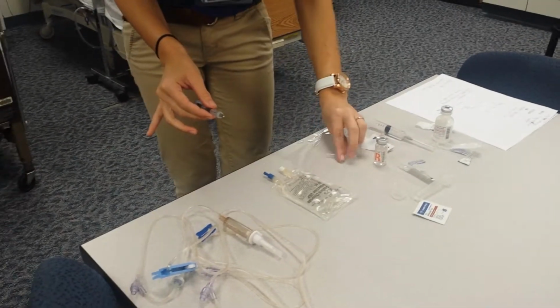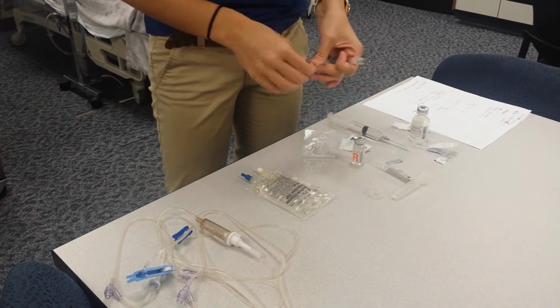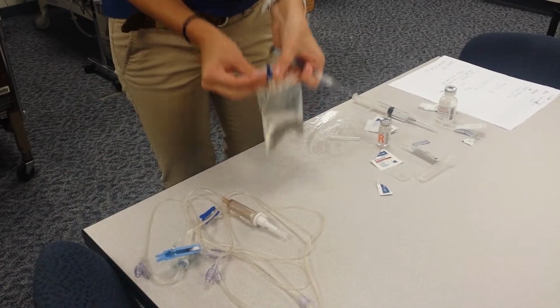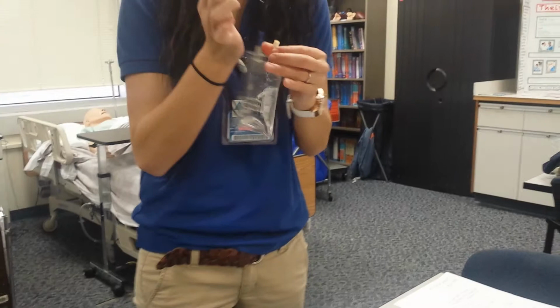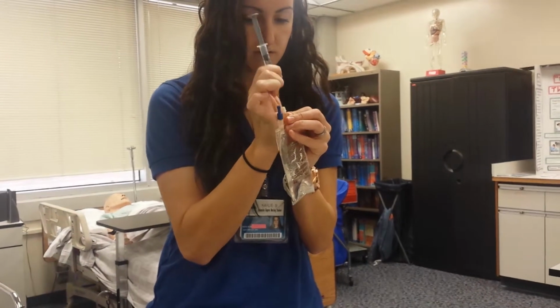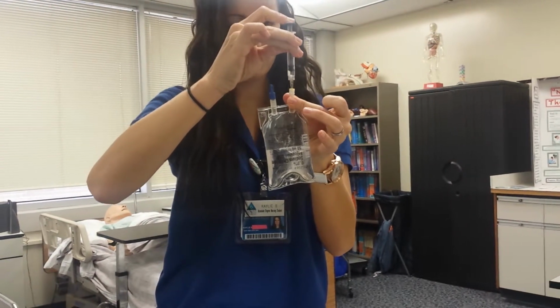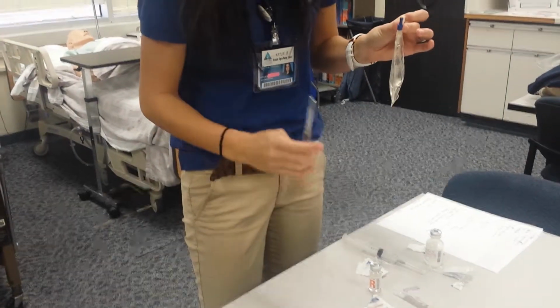I'm going to go ahead and cleanse the port on this and inject it directly into my 50 cc bag to make our concentration. And then I'm going to discard this needle directly in the sharps container.